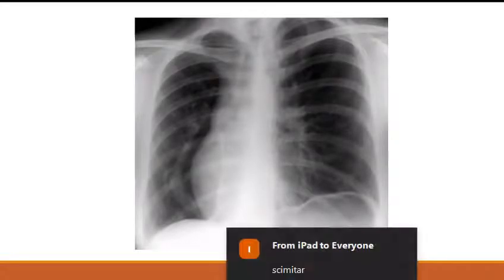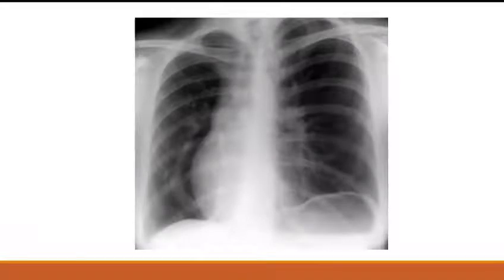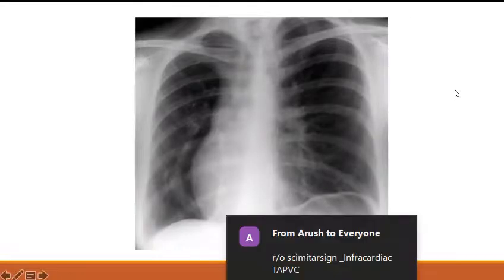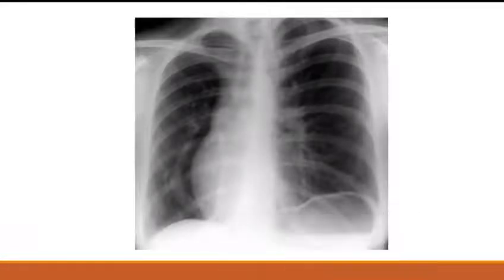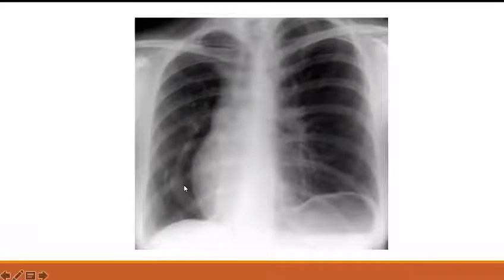This is a child with a moderate-sized atrial septal defect and moderate pulmonary arterial hypertension. Echo showed a moderate-sized ASD. On the X-ray, situs is solitus, and there is dextrocardia because the apex is on the right-hand side. On the right-hand side there is an opacity in the lung field — it is like the Turkish sword appearance, which is characteristic of scimitar syndrome with dextroversion.